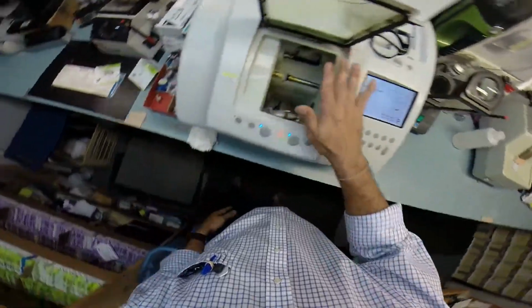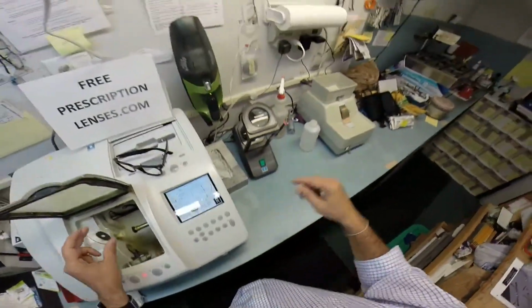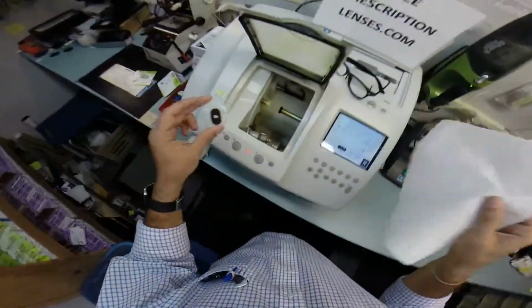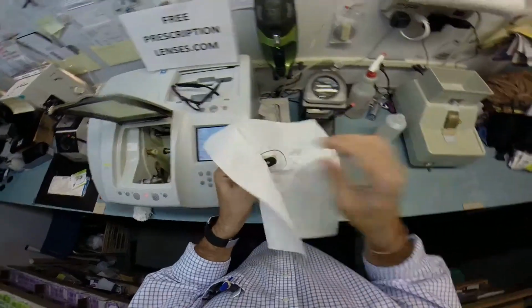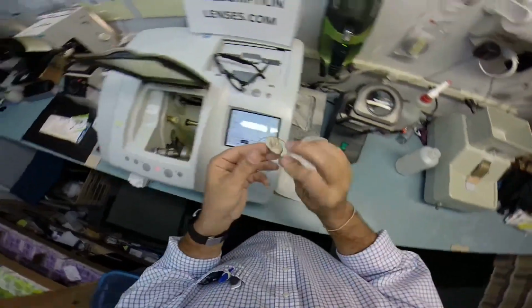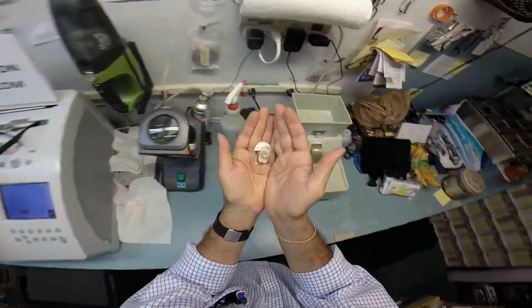So, hey, I recommend everyone go out and get this. It only costs $30,000. It weighs 200 pounds. Put it on your kitchen counter and you'll be able to cut lenses at home. You won't need me anymore. So what I'm doing here is I'm drying off your lens because I don't want it to be slippery, and it's quite embarrassing should you ever drop a lens on live TV. Just kidding, I wouldn't do it to you.